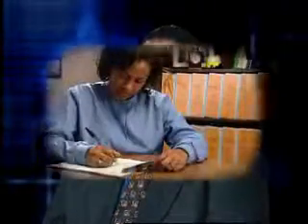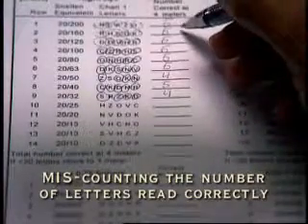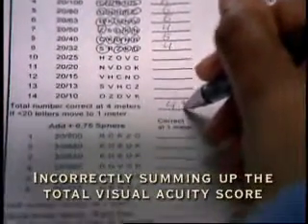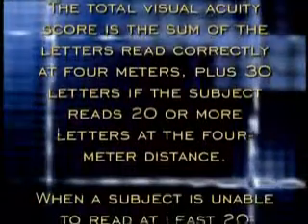After auditing numerous case report forms and visual acuity worksheets, we have noted that there are 2 frequently made errors. The first is miscounting the number of letters read correctly on each line of the visual acuity chart and circled on the CRF worksheet. And the second is incorrectly summing up the total visual acuity score. The total visual acuity score is the sum of letters read correctly at 4 meters plus 30 letters if the subject reads 20 or more letters at the 4-meter distance.